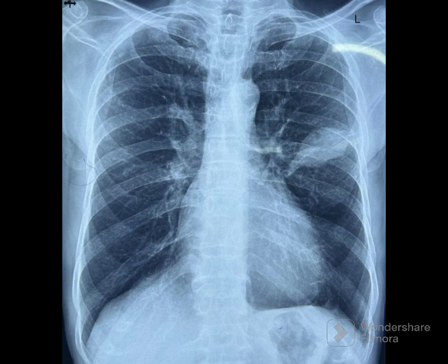Coming back to our chest x-ray, the lesion is not in the left oblique fissure. There are no other signs of congestive heart failure such as cardiomegaly, bilateral pleural effusions, or ground glass opacities in the pulmonary parenchyma. Hence, further evaluation with CT scan is mandatory in this case, as mass lesion is the most likely diagnosis based on the chest x-ray.